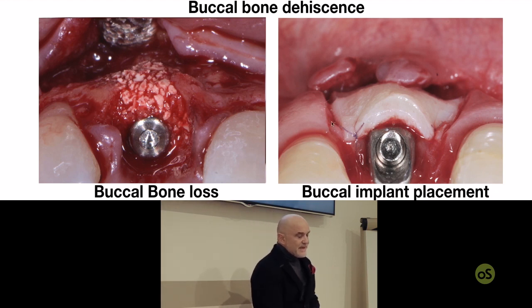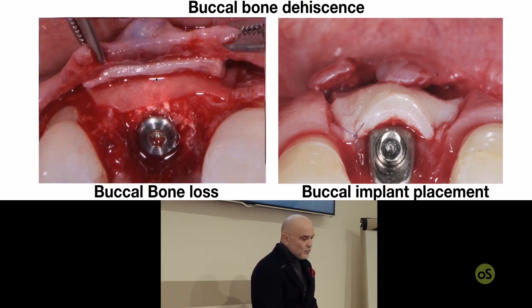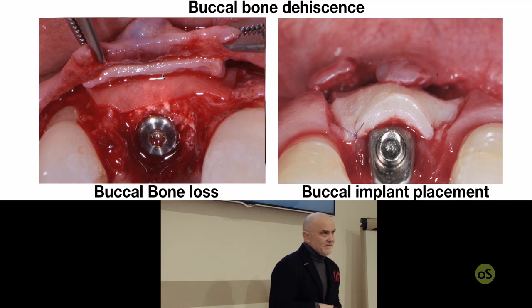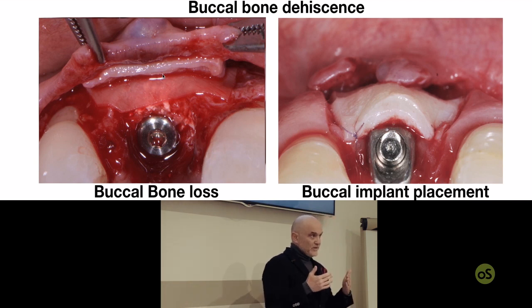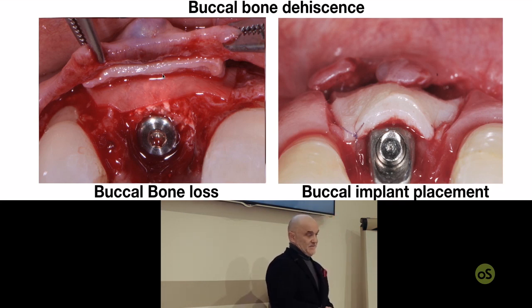So the use of bone and the use of membranes don't exclude at all the need of connective tissue graft in the most coronal area, where we also want to increase the thickness of the tissue, preventing gingival recession from forming at the level of the soft tissue margin.